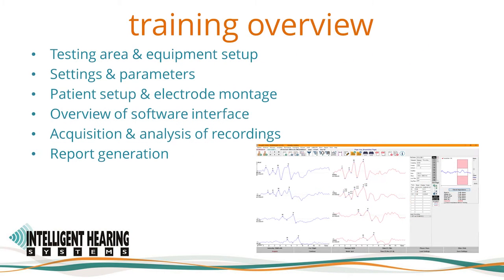This training video will provide a complete overview on best practices for recording ABRs using the IHS SmartEP system. We will begin with the testing area and the equipment setup, then cover the settings and parameters, the patient setup and electrode montage. After an overview of the SmartEP software interface, we will show you how to acquire and analyze recordings and finish with report generation.